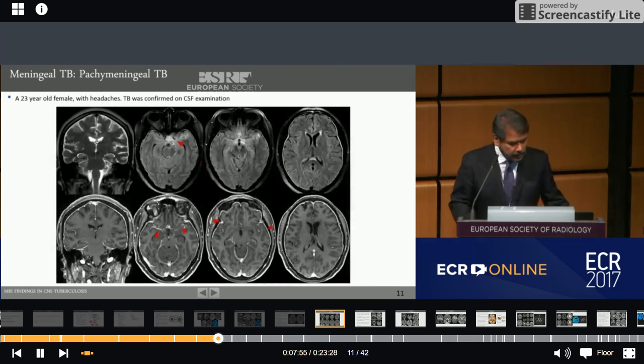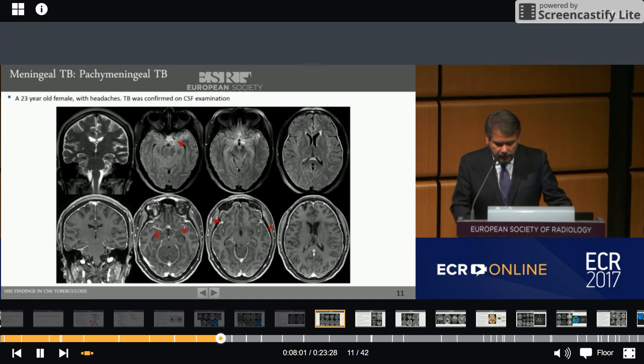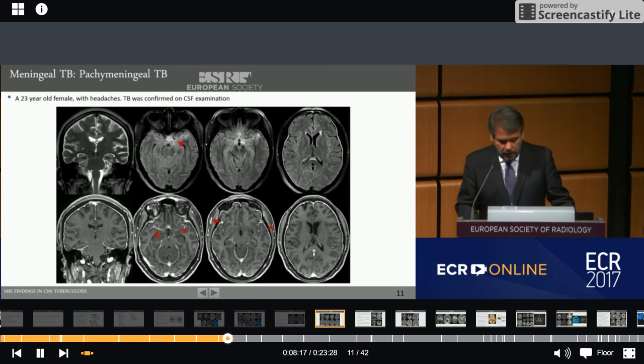This is a 23-year-old woman with headaches. Axial FLAIR images show hyperintensity and thickening of the pachymeninges. Post-contrast T1 axial and coronal images show diffuse enhancement of the pachymeninges, suggesting pachymeningitis. TB was confirmed on CSF examination.